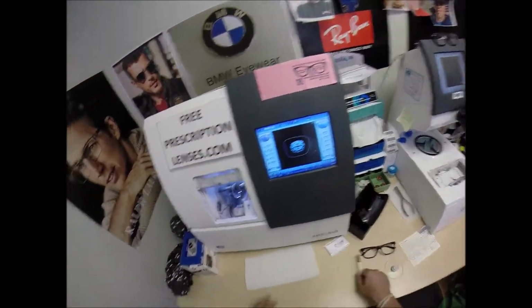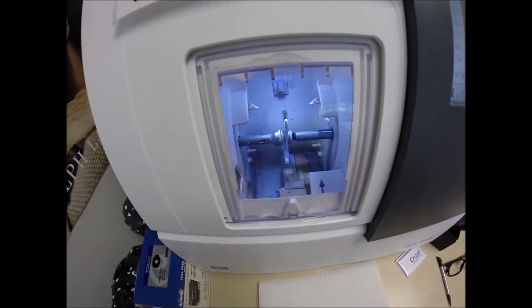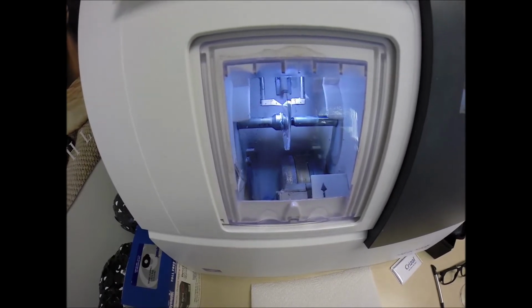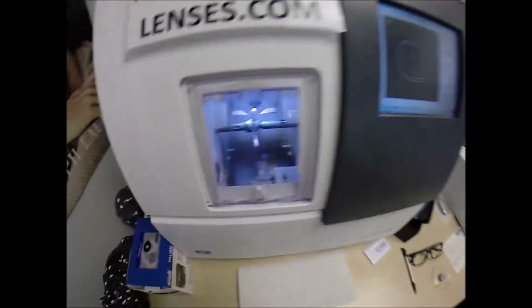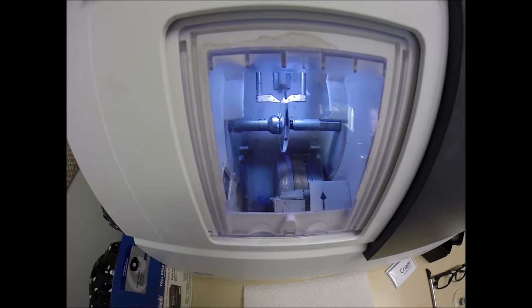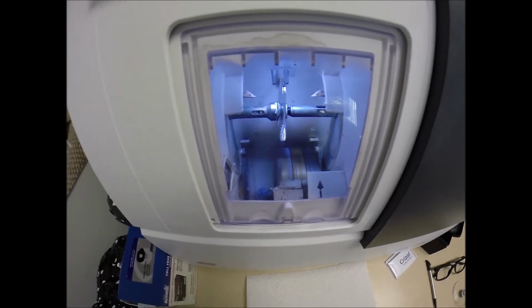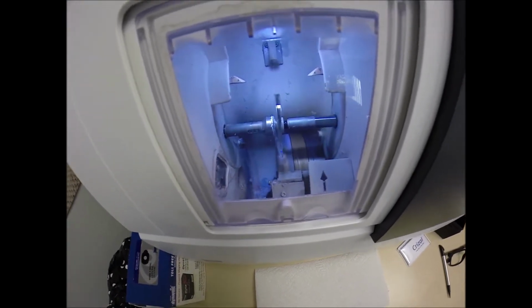Hit the green start button. The door closes. The clean door, I cleaned it today. The clamp shuts, and then the lens is going to be traced by 2 white styluses, making sure that it's large enough to fit into the frame. And you can see as it's tracing the shape of the right lens. And the old carpenter saying measure twice, cut once is measuring the thickness of the lens at every point to know exactly and precisely where to place the bevel so you have the least amount of edge thickness showing, of which you shouldn't have any in this frame, even with your higher than average astigmatism.